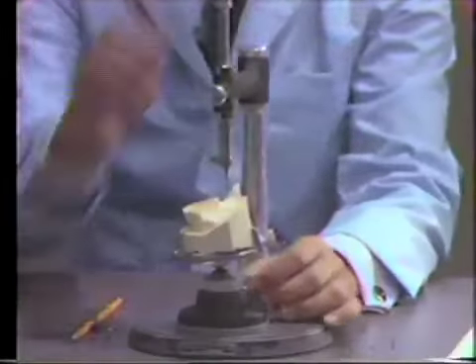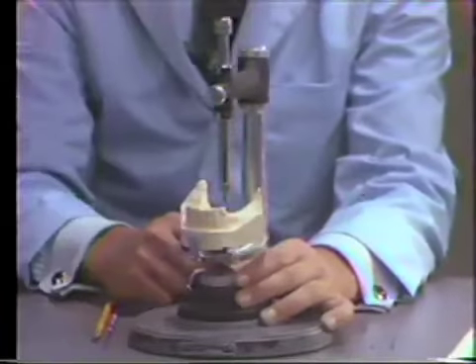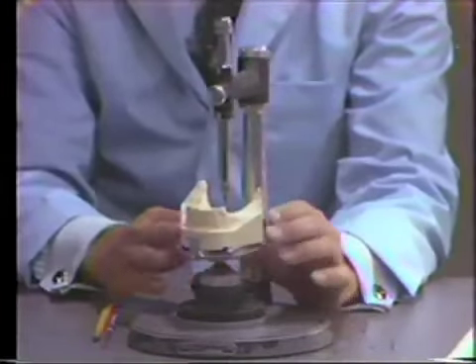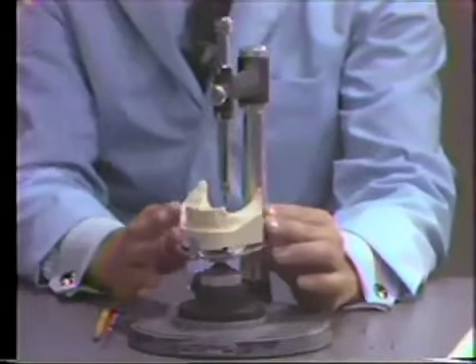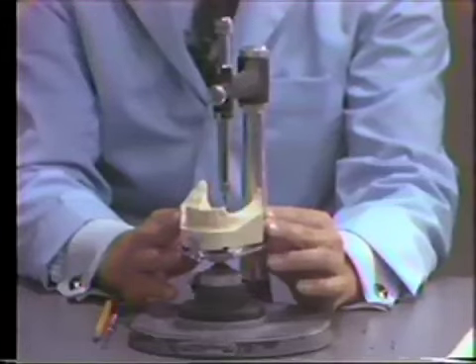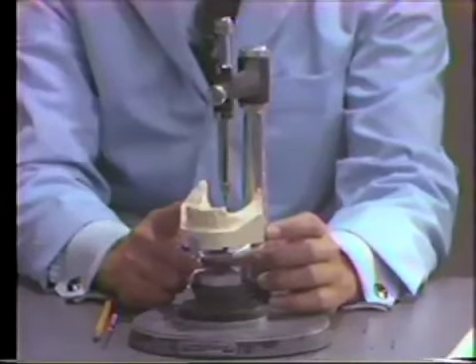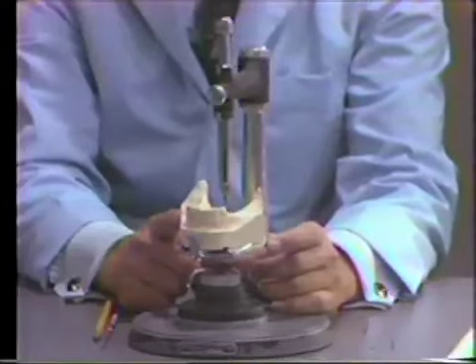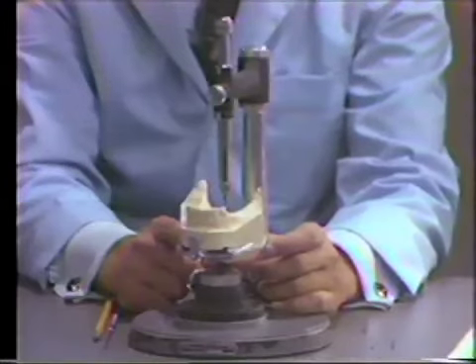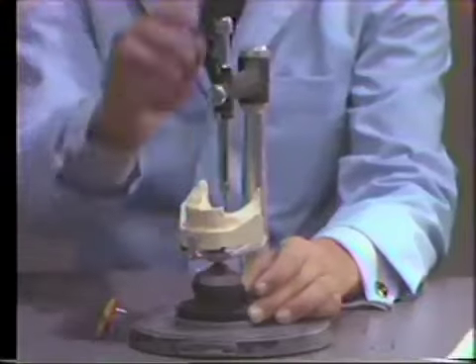I am able to take this cast off the surveyor, and I can reposition this cast in the same position, but I want to make sure that you understand it's only this cast, because if I take another cast and try to position it in this position, the base will be different, and so my markings will have nothing to do with repositioning a different cast, only the same cast. It will be necessary to tripod, which we will do a little bit later, to reposition a different cast of the same mouth in this same position.